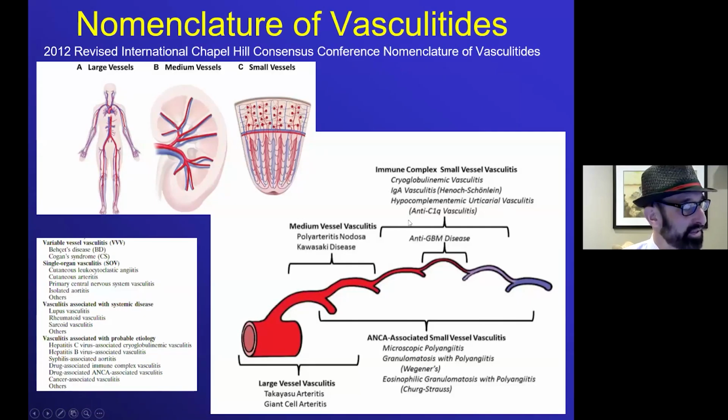So I'll end with this final slide. We've covered a lot of these entities, some of which we would characterize as vasculitis. Some of these we characterize as a vasculopathy without necessarily a dominant inflammatory component that would define a vasculitis. But I think that we've gotten a nice overview of a relatively obscure topic, and I hope you learned something from it. So with that, I am going to stop my share, show my happy face, and go to the question and answer.